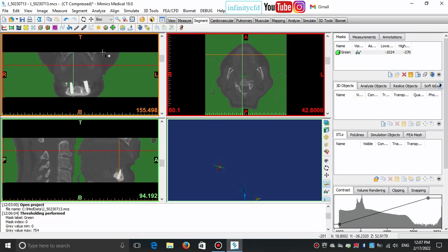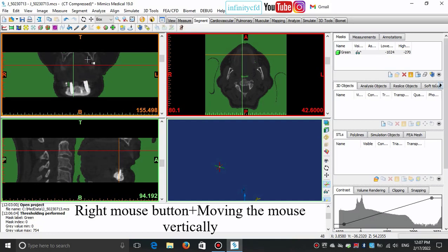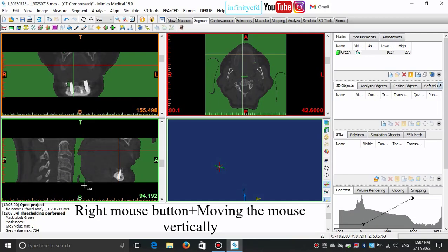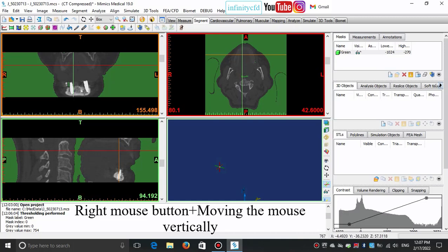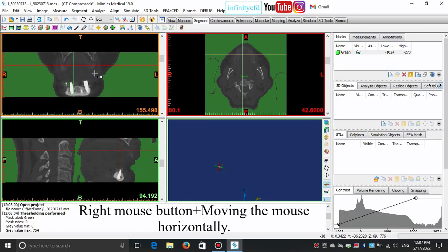Move the mouse while holding the right mouse button down to change the contrast. It just works in 2D views. By moving left and right, you can change the brightness.